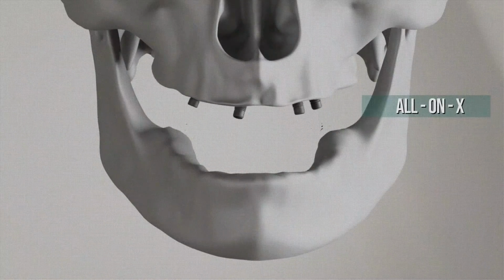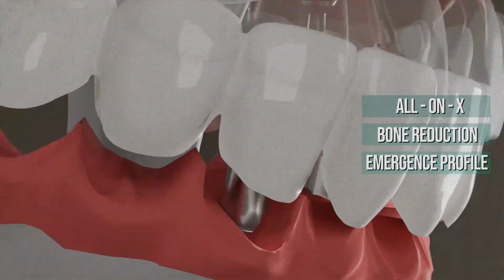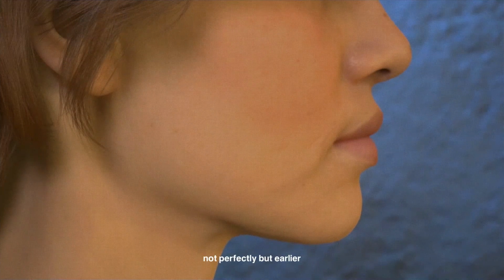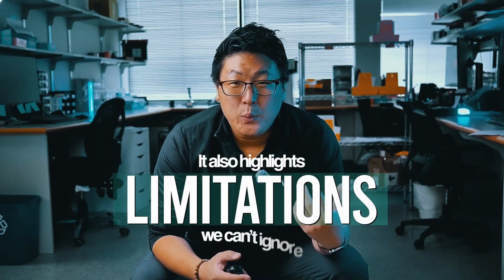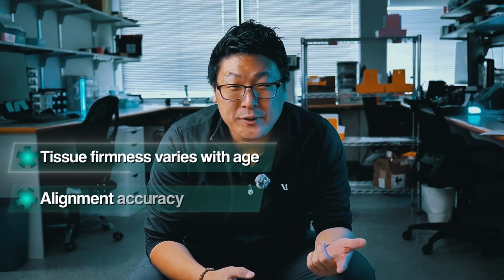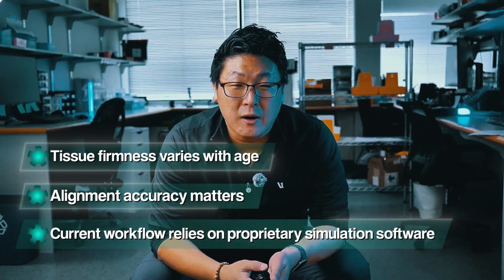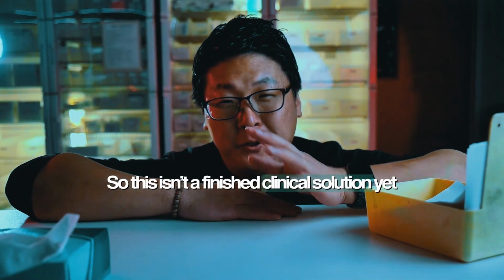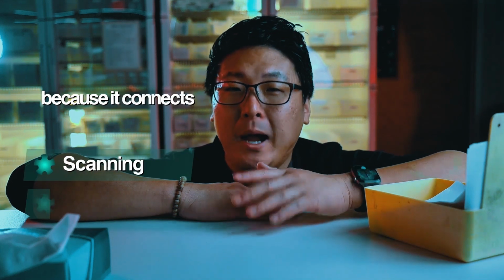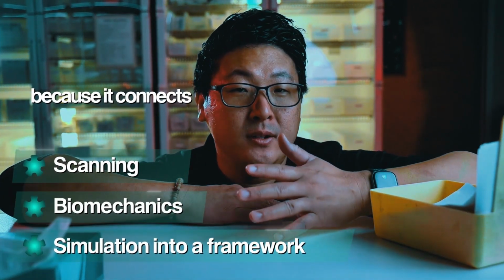In All-on-X specifically, this could help visualize how bone reduction, emergence profile, and prosthetic volume interact with the face. Not perfectly, but earlier. It also highlights limitations we can't ignore, which is tissue firmness varies with age, alignment accuracy matters, and the current workflow relies on proprietary simulation software. So this isn't a finished clinical solution yet, but it's a breakthrough in thinking because it connects scanning, biomechanics, and simulation into a framework that lets us ask better questions earlier.